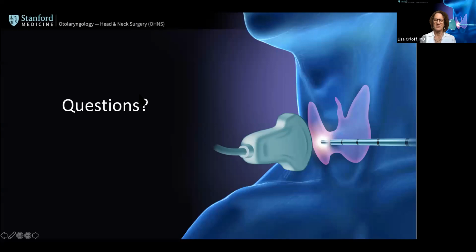I interpreted that question slightly differently. I thought it was referring to a so-called higher false negative rate of FNA above 4 centimeters, which is also debatable. And you kind of mentioned that, Leonardo. I think the false negative rate of FNA shouldn't be more than 5%. But there's always the option of repeating a biopsy, beyond a second biopsy. You can biopsy definitely with ultrasound guidance to target the more solid or most suspicious area of a nodule. But as you mentioned, I think that consideration of molecular testing can also help with stratifying those nodules further.